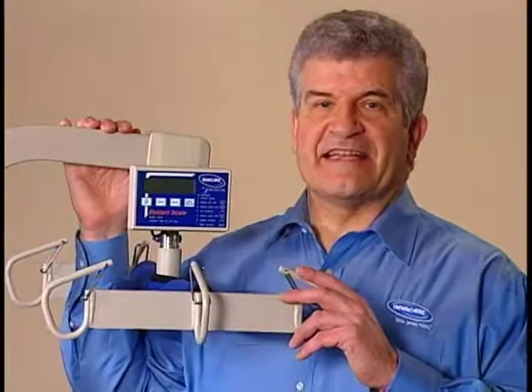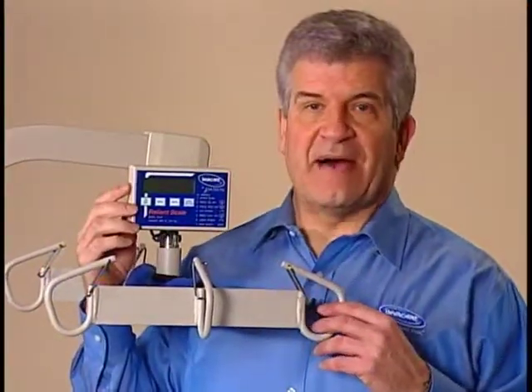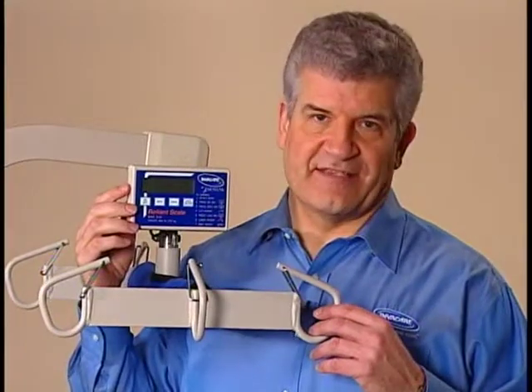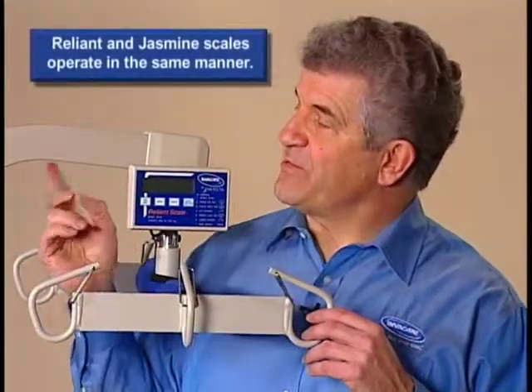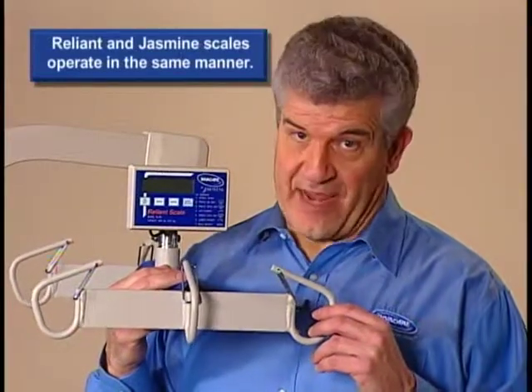You can minimize resident handling by using the optional digital scales to combine the transfer and weighing processes. The scale is mounted between the boom and the swivel bar. It can be set to display either pounds or kilograms.